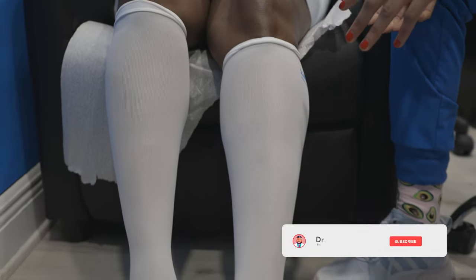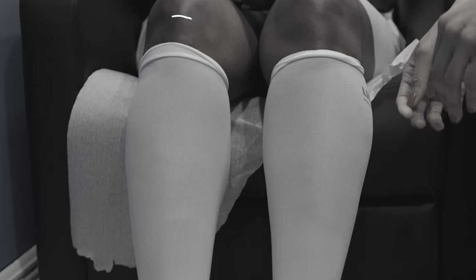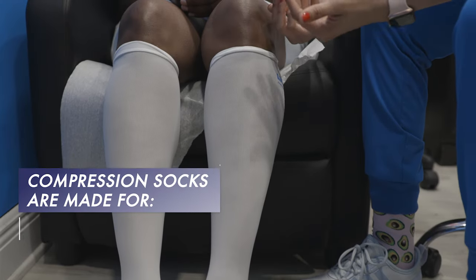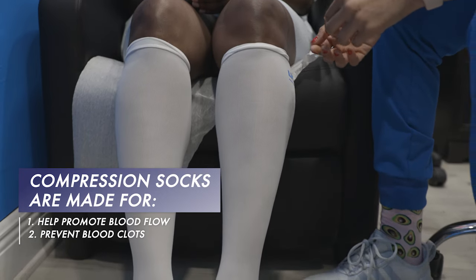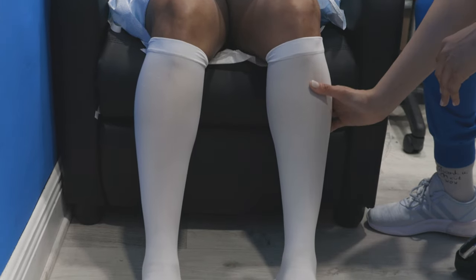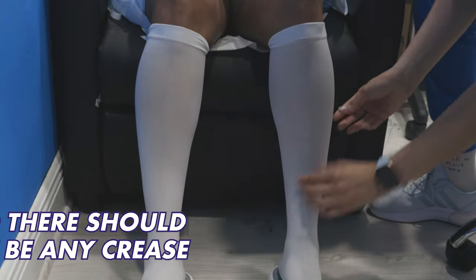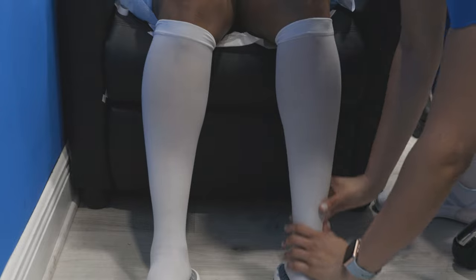You see here how the compression sock is a bit tight around this area — we want to avoid this at all cost. Compression socks are used to help promote blood flow and prevent any blood clots that could happen with surgery. Compression socks should fit smooth throughout your leg. This is going to help give you all the blood flow you need. This should not be tight and there should not be any crease like this — it should be smooth throughout the leg.